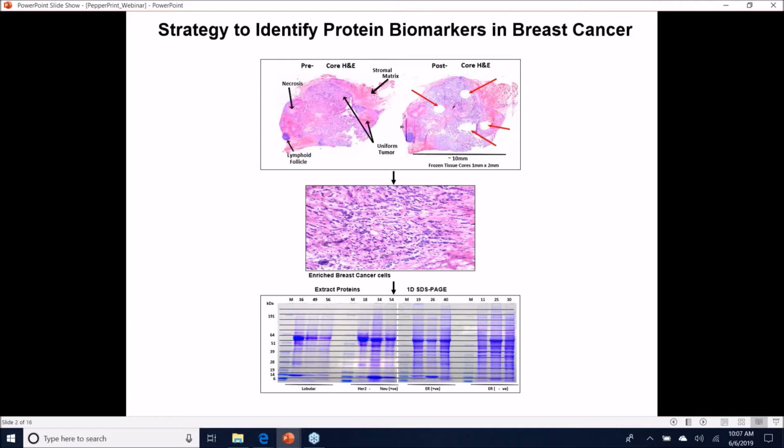So the question becomes, what kind of mutations do you download? So we started downloading from available mutation data from publicly available databases. And then we were just comparing our samples against these mutations that have been commonly described in the database, which I think is not necessarily very systematic, but that's how we started.